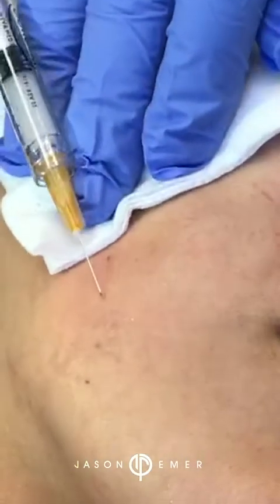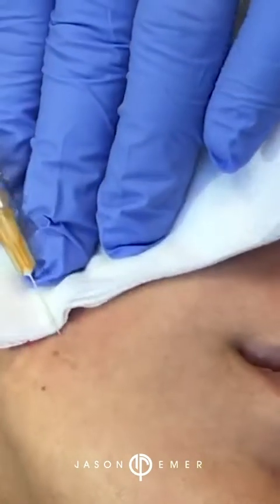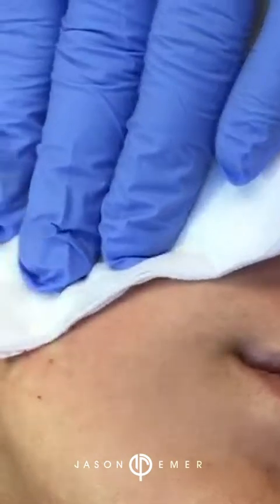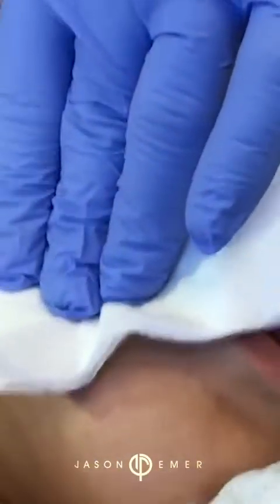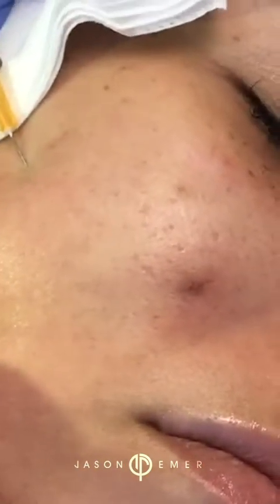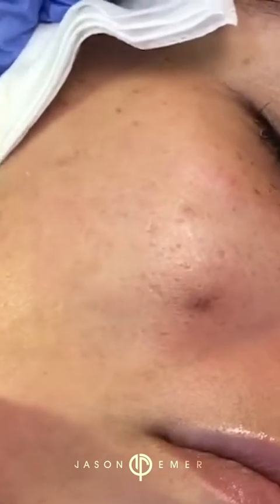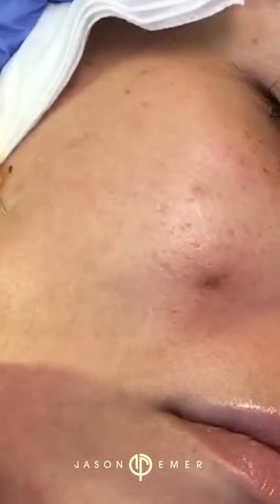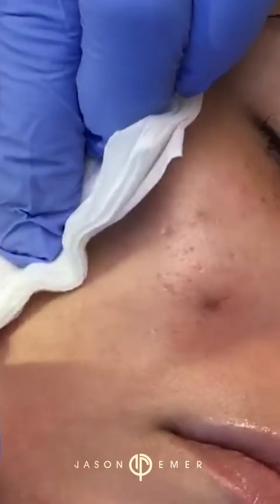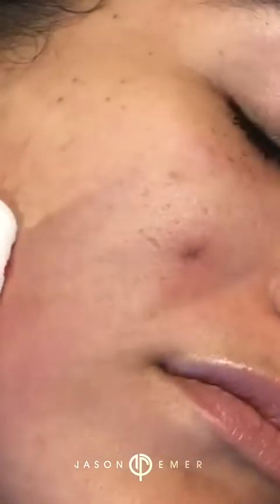The interesting thing about Bellafill is that it's the only filler in the United States that still has collagen in it. So one of the things you must do before treatment is a skin test. That's an important thing to know. If anyone tells you not to do a skin test with this filler, I wouldn't suggest that. Even though the rate is very low that people get allergic reactions, you wouldn't want to put something in your skin that has the potential for an allergic reaction years later. We don't want to do that. So that side looks great. That's complete. Went right under those.